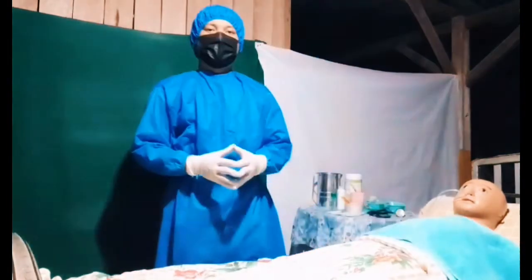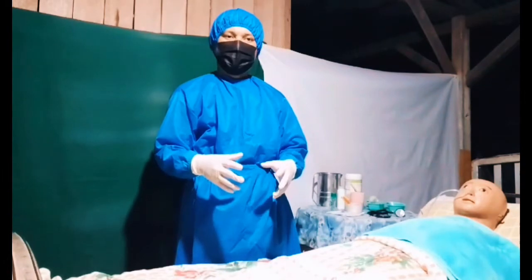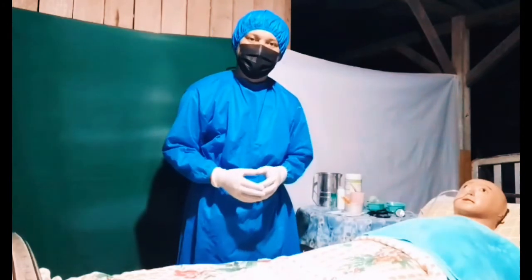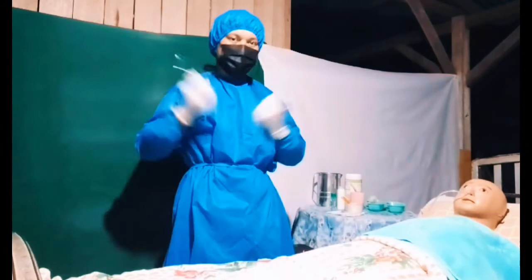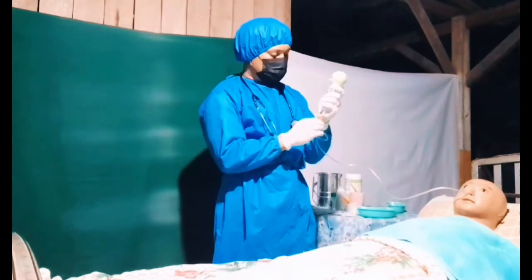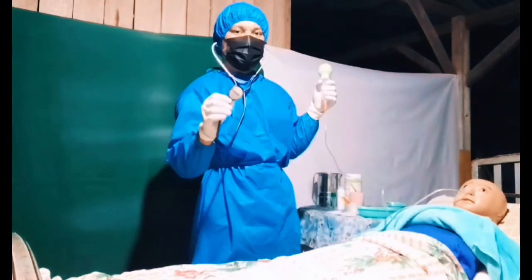So, now, to make sure that the tube is in the stomach, you must check the placement of the tube. We're going to need a stethoscope and an asepto syringe. Put an asepto syringe in the tube. Put the stethoscope on the stomach. Introduce air.